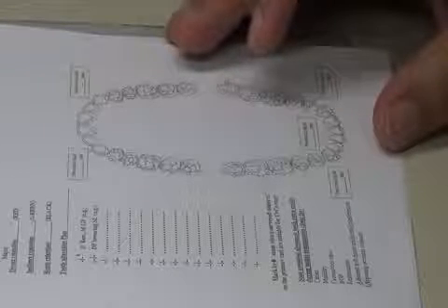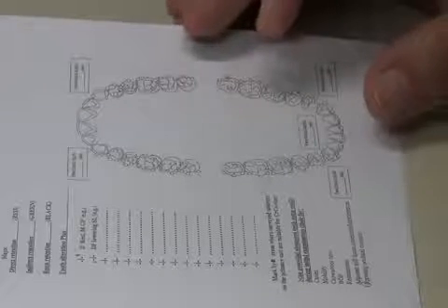So the empty form that we're going to fill in is always accompanied by the first page, which we said is the sequence of surveying on this side and the sequence of surveying of casts on this side. And then the steps for chrome-cobalt design are included in this slide, okay? This is to remind you of each component, so you don't forget it while you are doing your design. It also gives you some indication on how to review any design, okay?